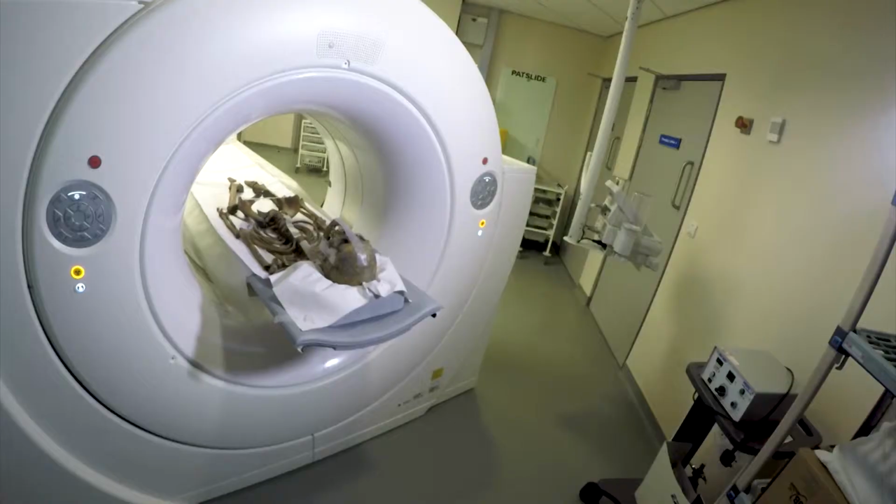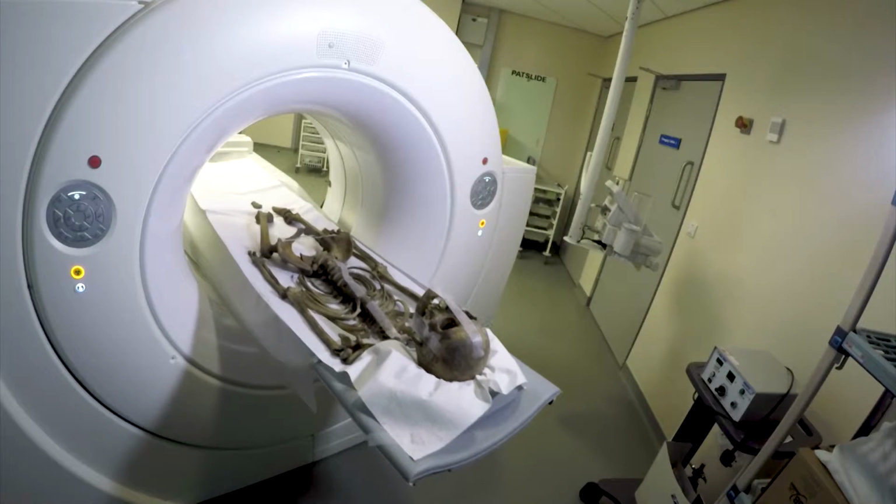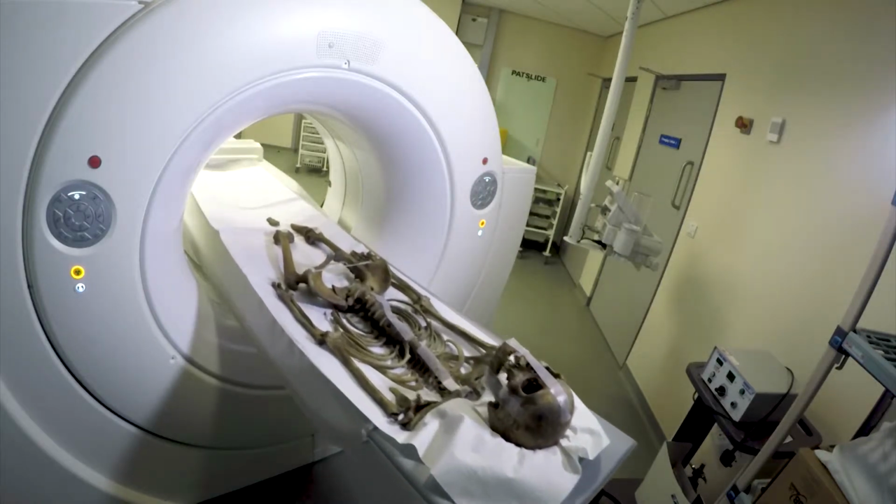And then using a powerful computer you can reconstruct that to show slices through that bone or that part of the body, or you can use the data to make a 3D picture. And we've used a combination of both of those for this exhibition. One of the people that we scanned part of their pelvis. It was in several fragments, but we taped those together in the way they would have been during life, and acquired a 3D picture of that.